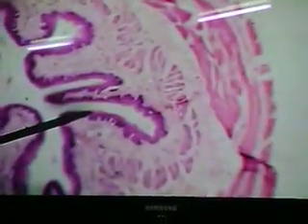Okay. Let's look at this other slide here of the esophagus. So there you see the mucosa quite folded. There is the lamina propria, and notice that we don't see any real glandular tissue, right? Nothing that we can see right now. So I suspect it could also be the middle third, no glandular tissue. Muscularis mucosae very prominent. Let's look at the outer layer here.